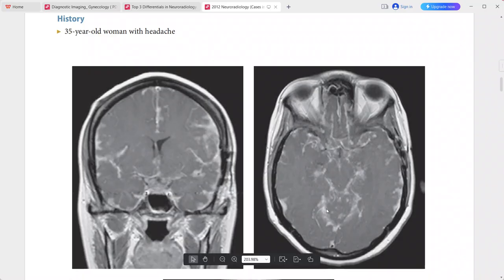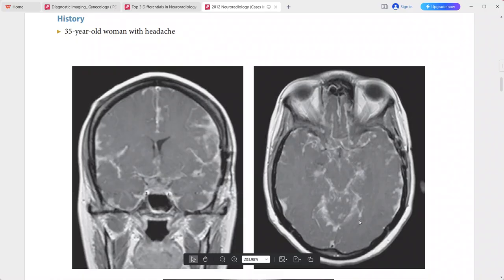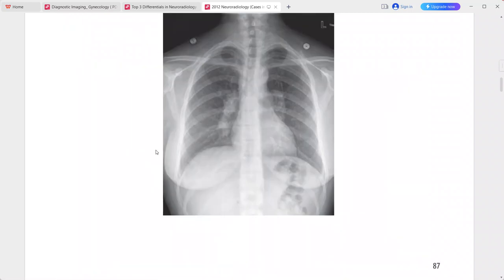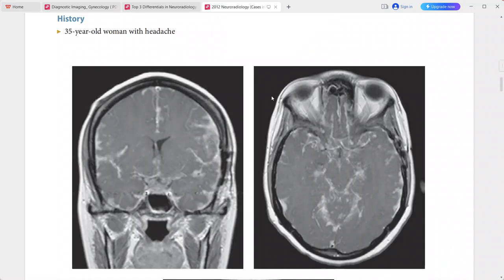Chest X-ray shows bilateral hilar lymphadenopathy. Correlating these findings, the main diagnosis is neurosarcoidosis. Differentials include tuberculosis, carcinomatous meningitis, lymphoma, fungal infections, and Langerhans cell histiocytosis.